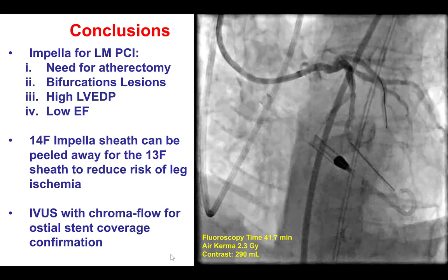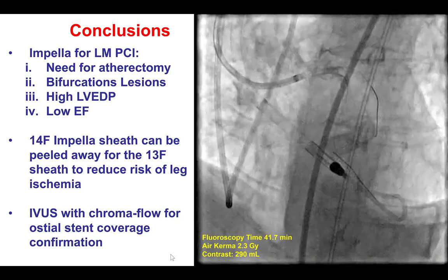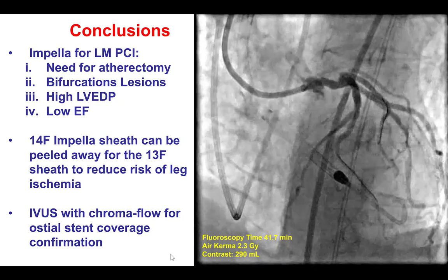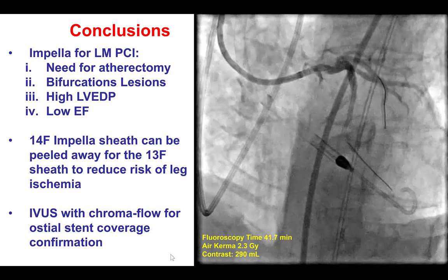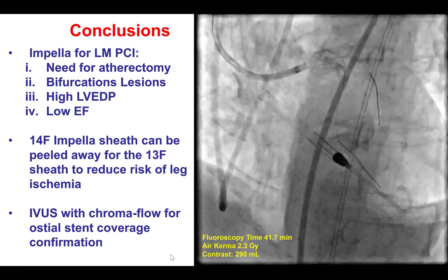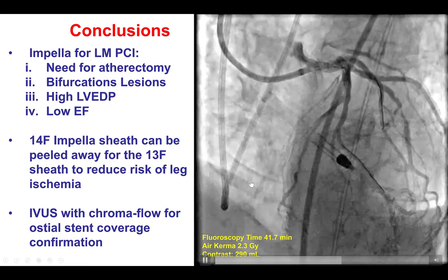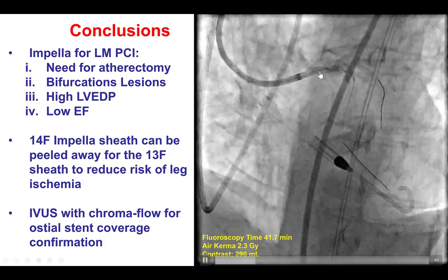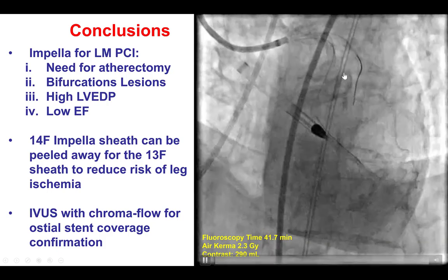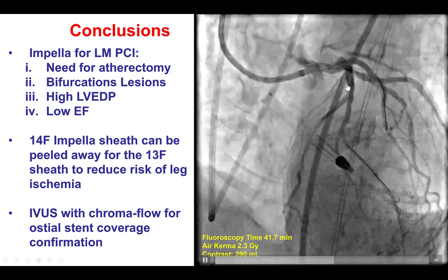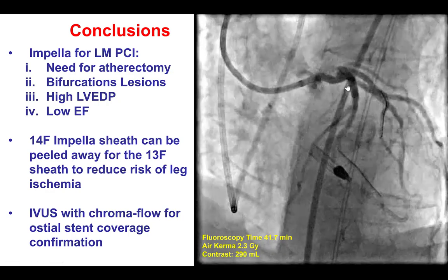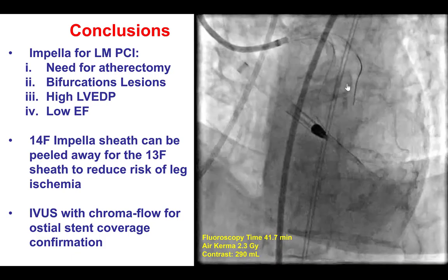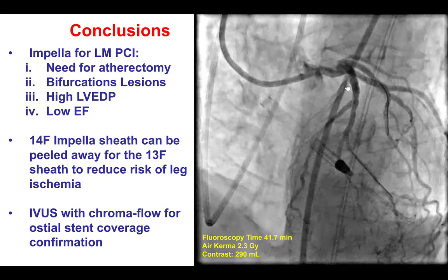Third, when you have significant calcification, it is important to prepare the vessel well before stenting. In this case, the arc of calcium was 180 degrees, so we did not use atherectomy. We did use imaging that showed good stent expansion at the end, and we confirmed coverage of the ostium of the left main with intravascular ultrasound. We used the provisional stenting technique, stenting into the LAD and jailing the other two vessels, which did not seem to have significant disease. One can do pressure wire to assess those vessels, though we could not deliver it in this case, but there was no angiographically significant disease at the ostia of those vessels. Thank you.